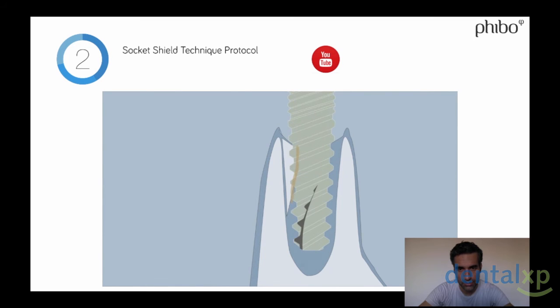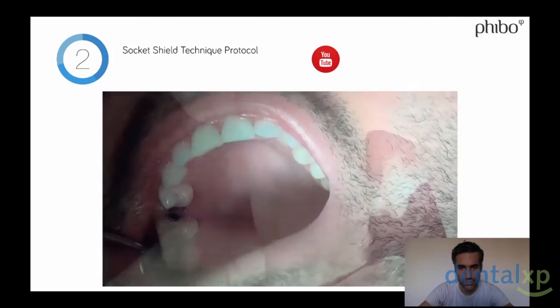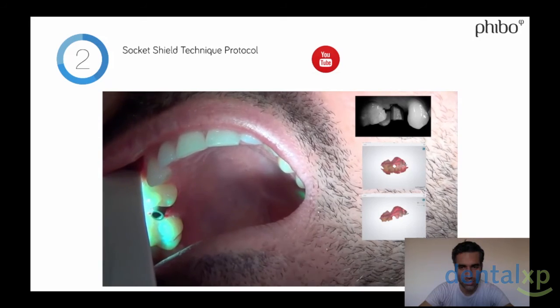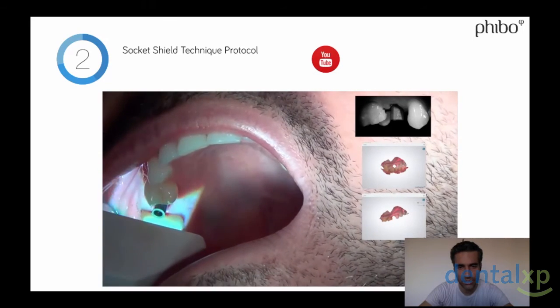So as you can see, it's a very sensitive technique. It's for expert hands. But as you can see, the process is not quite difficult. Then we have to scan. We scan the emergence profile, but also the position of the implant with the scan body.